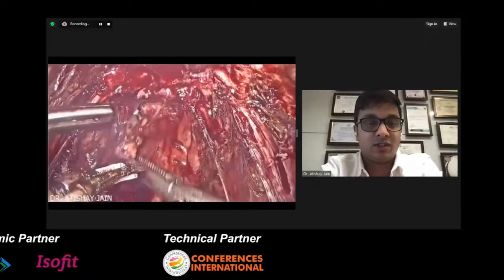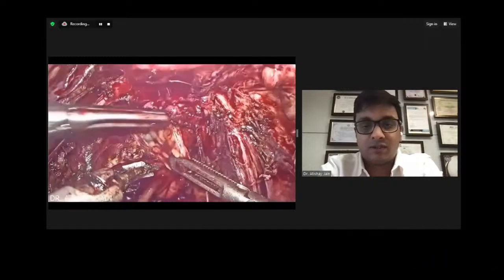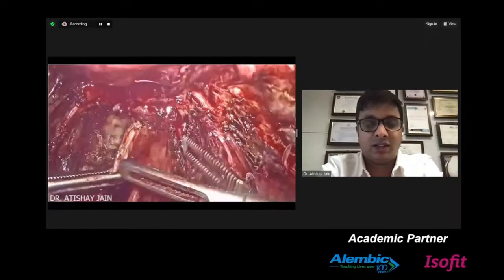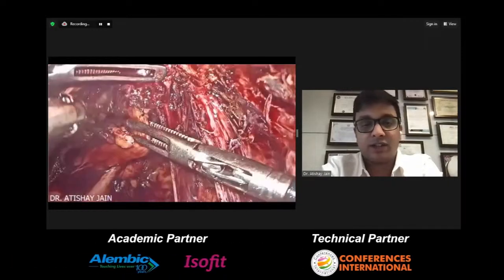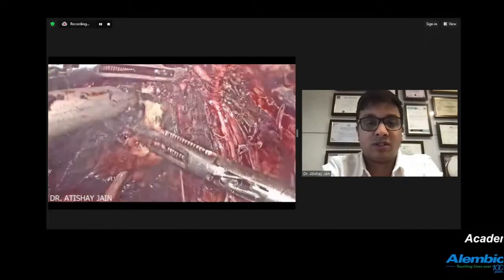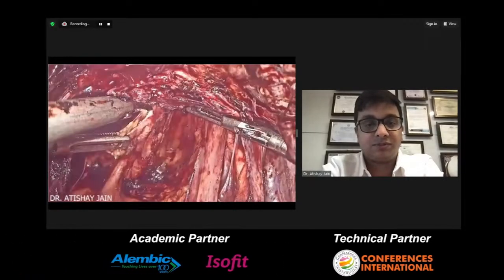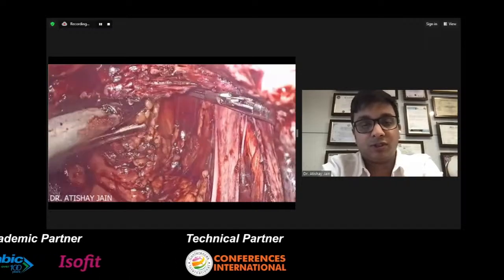And here, as you can see, we are just about to open the rectovaginal space, and we are just keeping the fat below and cutting right above it. In such cases, you can take help of the rectal probe, and also in some cases where that's not well demarcated, you can use a gauze in the fornix also.